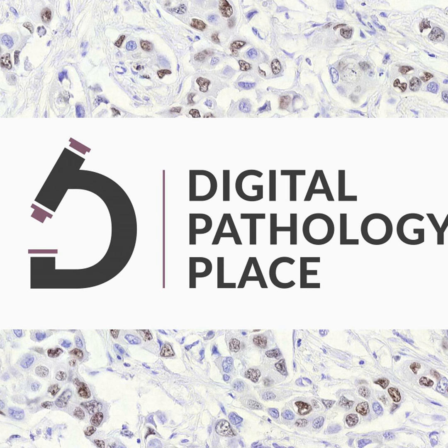The AI model showed excellent performance, with an area under the receiver operating characteristic curve of 0.965 for detecting what? Nodal metastasis, so not the nevi yet. And in comparison, the AUC for nodal metastasis among dermatopathologists ranged between 0.94 and 0.98. So we are at the same level. This is fantastic.